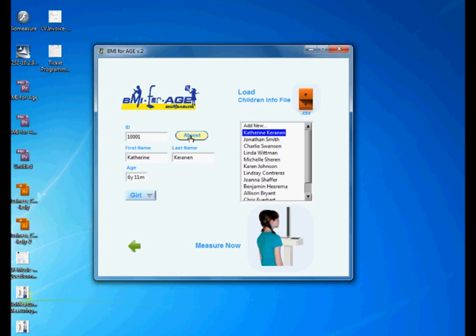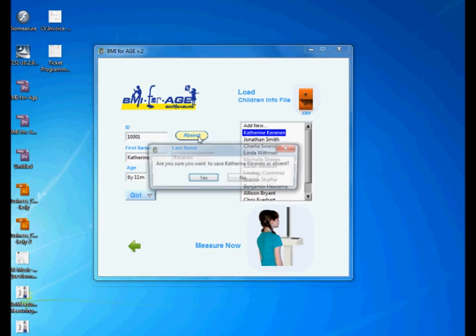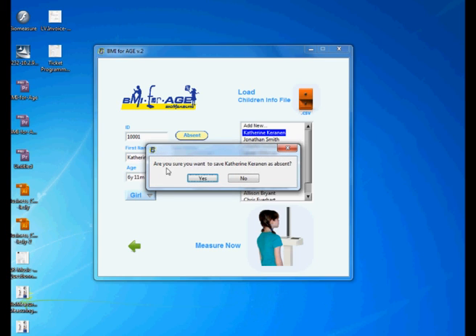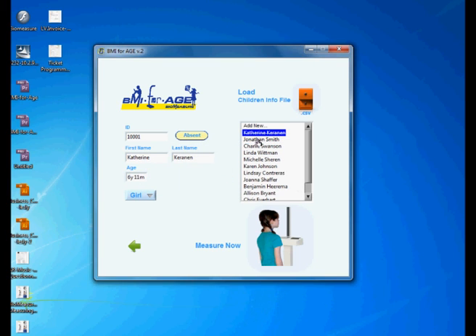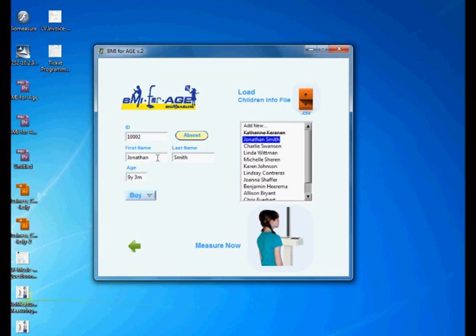This button here, absent, is a new feature added to BMI4H. What this does is if, let's say Catherine is sick today, couldn't make it today, then I am going to save Catherine as absent because I still want Catherine to get the readings but somehow I have to mark her as absent today. So I'm gonna click here and it asks are you sure you want to save Catherine as absent, yes or no? I'm gonna say yes because Catherine is not here, so I'm gonna keep going with Jonathan.